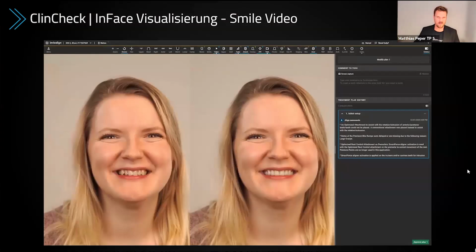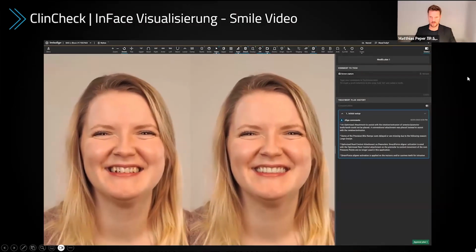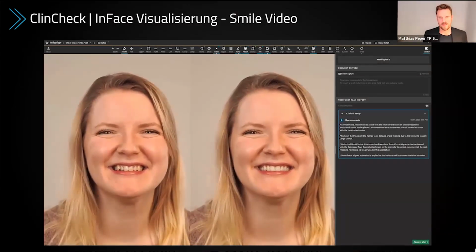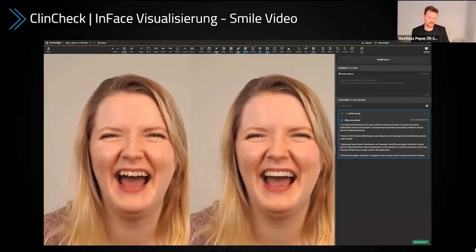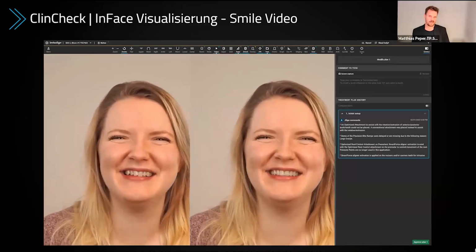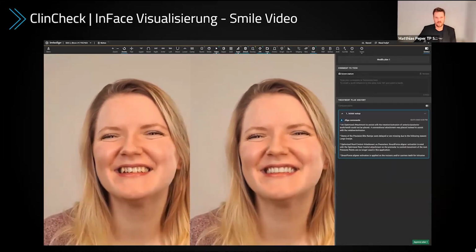What helps us a lot, and this is also a new feature from Invisalign, they call it in-face visualization and smile video. And this is very interesting. So you not only have the chance to create a picture, you also have a chance to see the corrected situation while the patient is talking. And so that's much better and easier for you to identify where you would like to go.